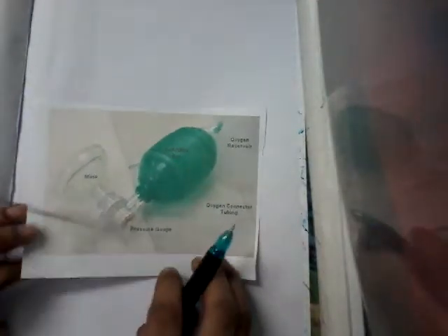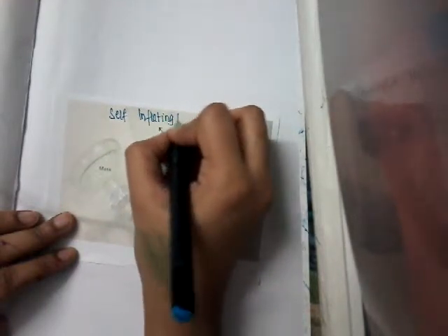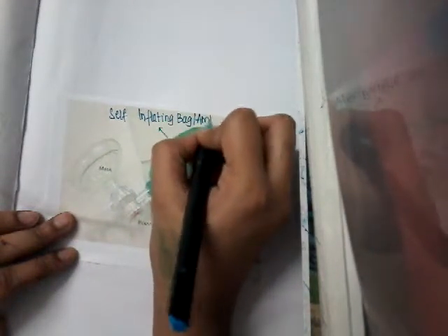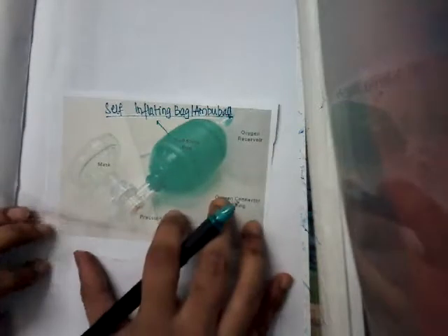Hello friends, welcome to a new lecture on pediatrics instruments. In this lecture I will explain about the self-inflating bag, also called the Ambu bag.